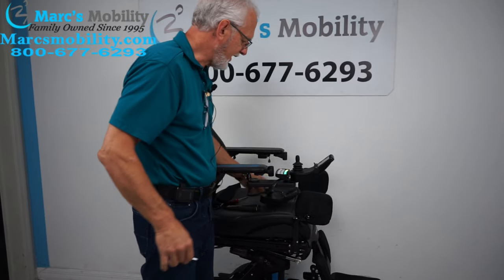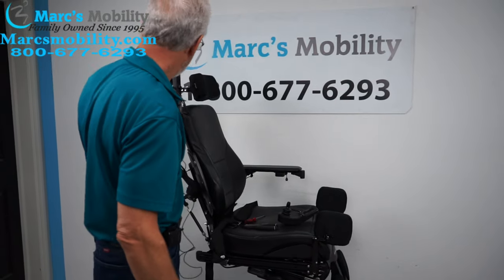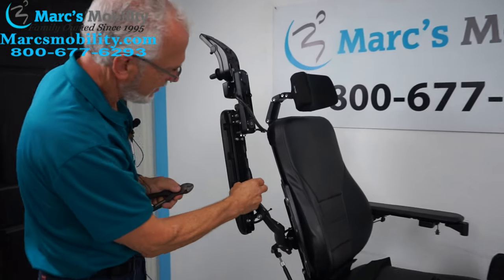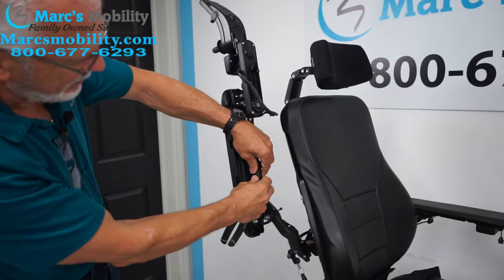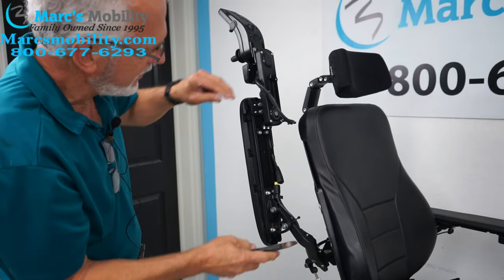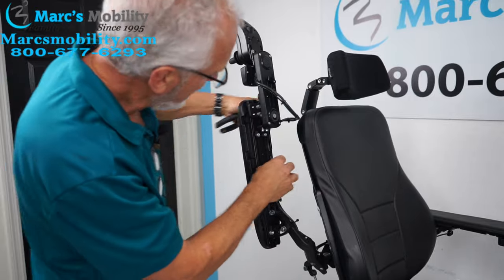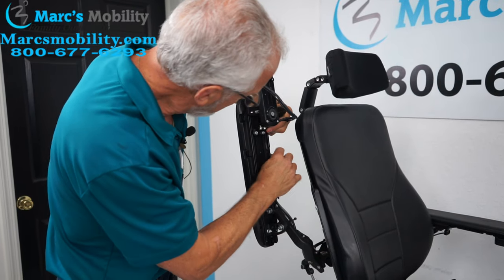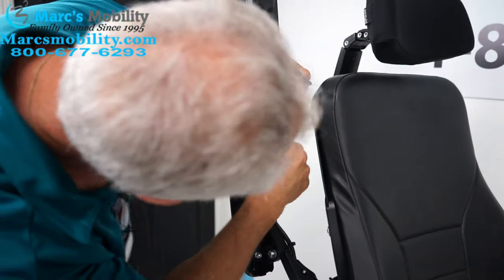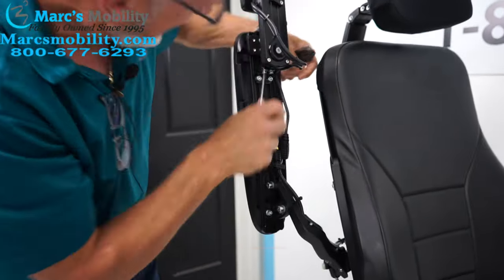What you do is raise the arm up like this. You can see the cable runs to here, so you can actually unplug it right here. That's your joystick cable. There's a little cable that comes with it — you have to take that cable out, pull it out of here. There's a little plastic tab here; you can pull those tabs out and pull the cable out.